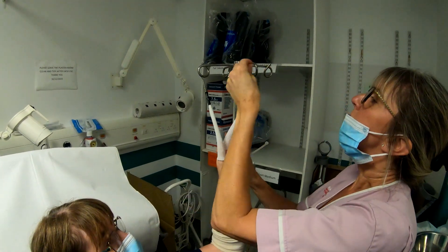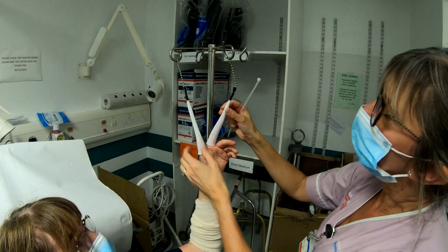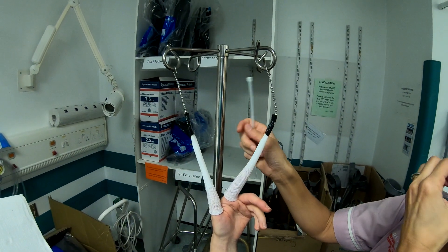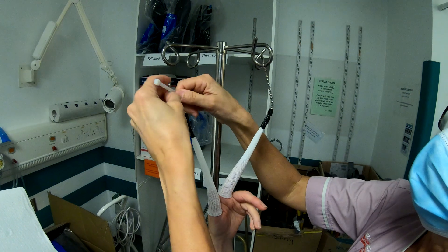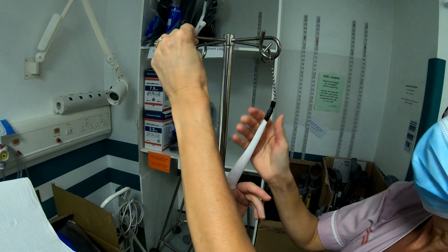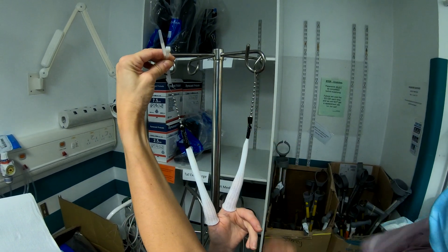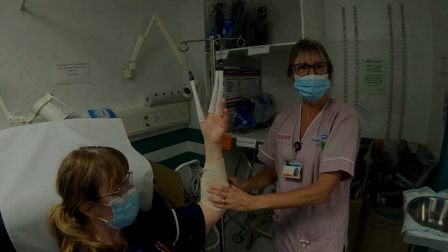Just to demonstrate: if one of the finger traps is a bit loose and the traction isn't equal — one taut, one not — you can extend the taut one with a cable tie to even them out. By adjusting the cable tie to reach the other finger trap, dropping it slightly makes both at equal traction. Use a cable tie to help achieve equal traction.